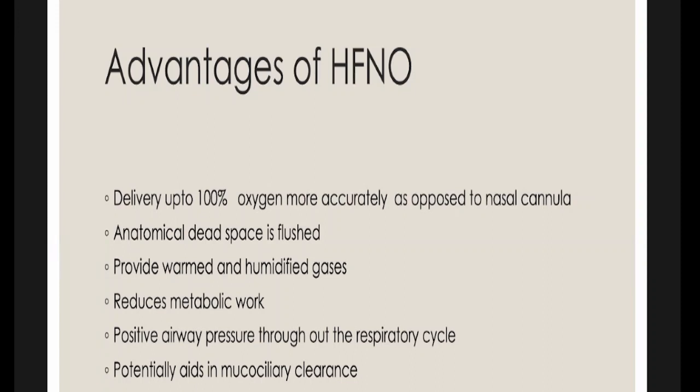Right, so the other advantage is, it also flushes the anatomical dead space. Can you remember the anatomical dead space? How far does it extend? Starting from the nostrils up to the bronchioles, you have the dead space. This dead space is being flushed by this high flow, because it has a higher flow rate. It has the power to flush it. And it provides warmed and humidified gases and reduces the metabolic work.